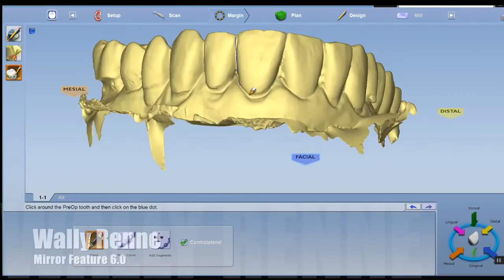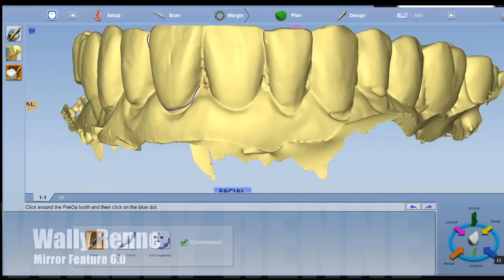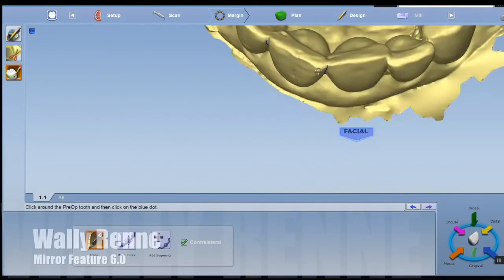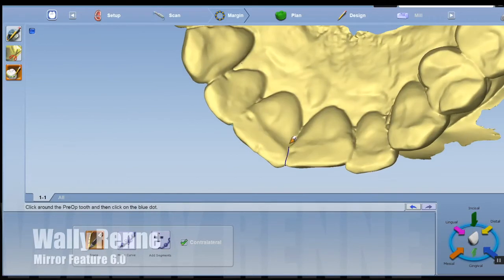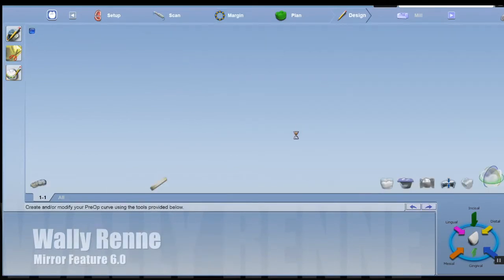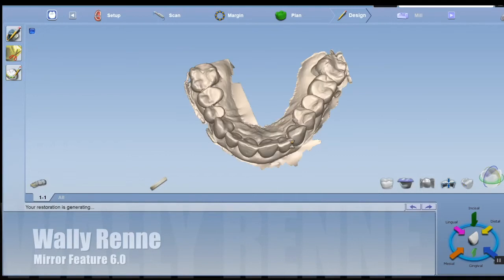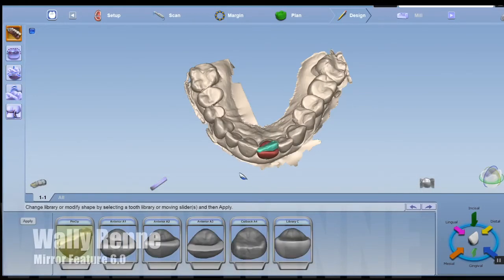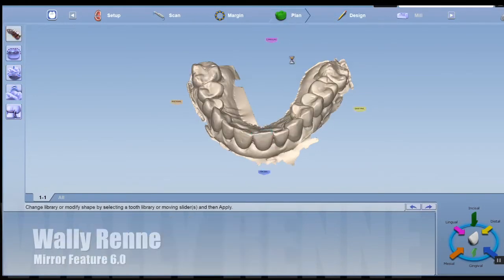I'm going to use the new mirror feature. All you do is outline the contralateral tooth of which you want to mirror. When you go to the plan tab, it's actually going to show a silhouette of that tooth.